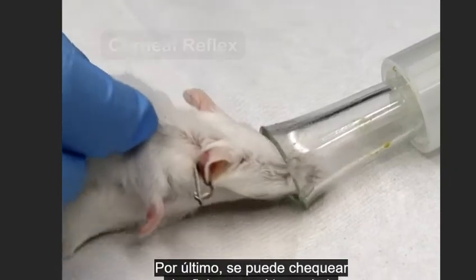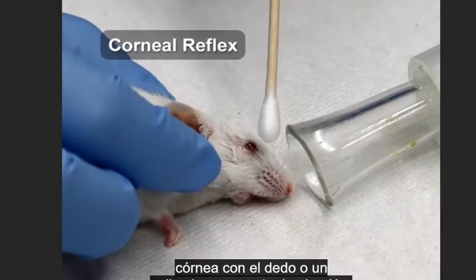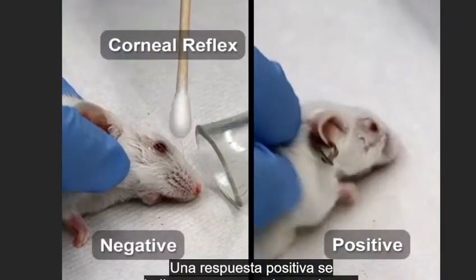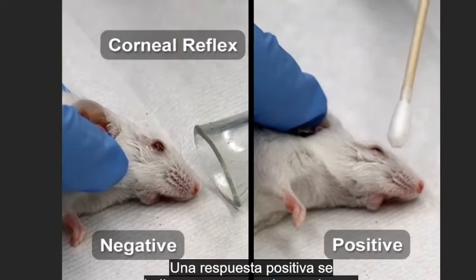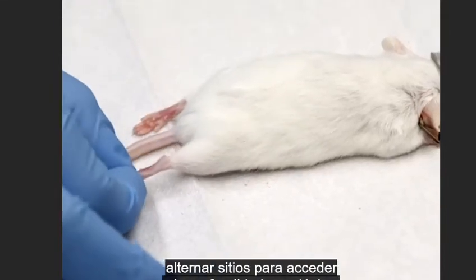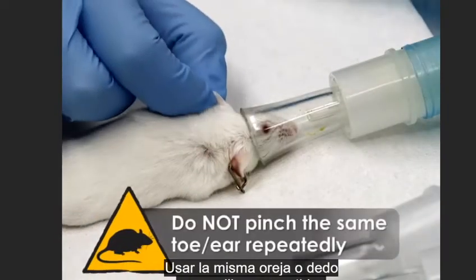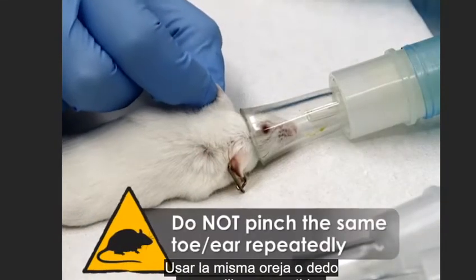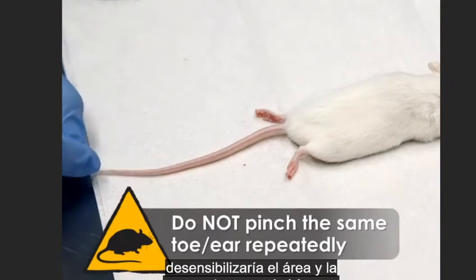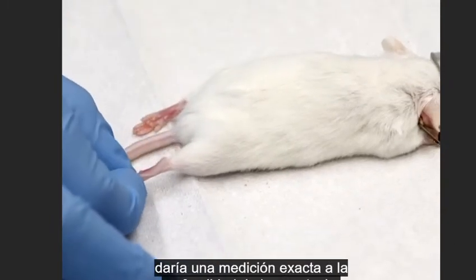Lastly, one can check the corneal reflex by touching the cornea with a gloved finger or a cotton-tipped applicator; a positive response is indicated by a blink. It is important to alternate between sites to assess anesthetic depth, as using the same toe or ear for repeated pinches will desensitize the area and the response will be repressed, not giving an accurate assessment.